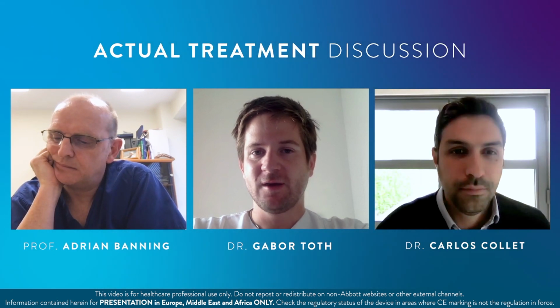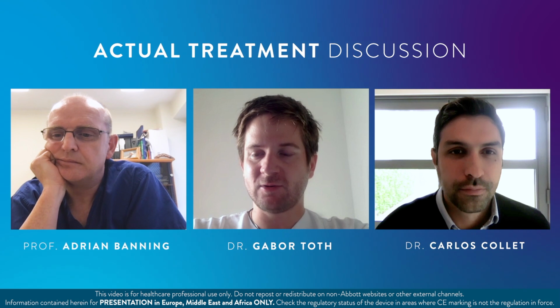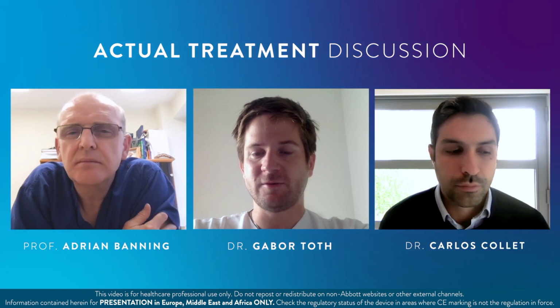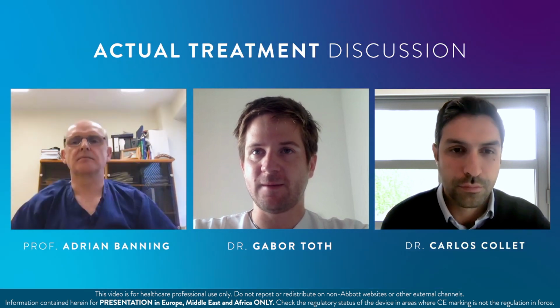I think the most important thing here is to avoid adding multiple layers to that. So I think the approach with the balloon and drug-eluting balloon is a really good choice. Of course, you have to see whether after lesion preparation you have a good enough result to go on with drug-eluting balloon. But as long as the lesion preparation allows you with its result to go for drug-eluting balloon, I think limiting the layer of metals is a very good choice.